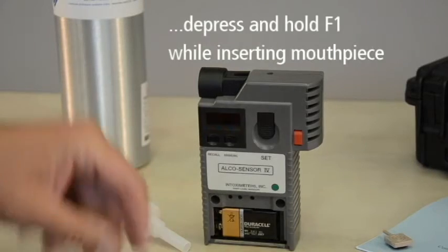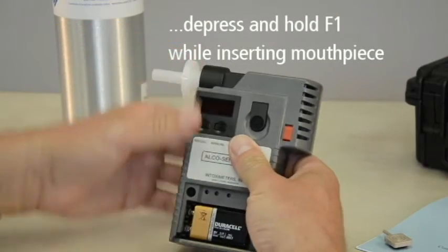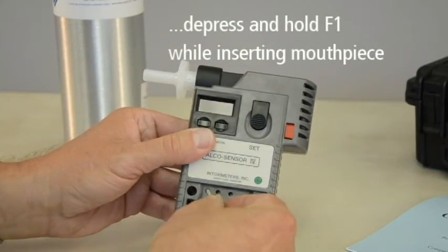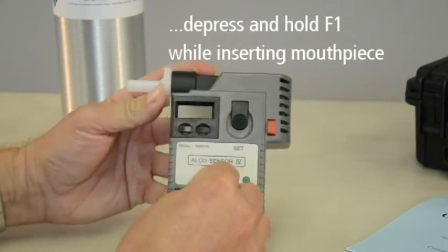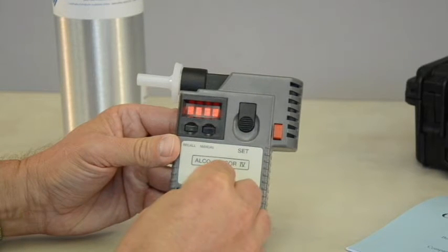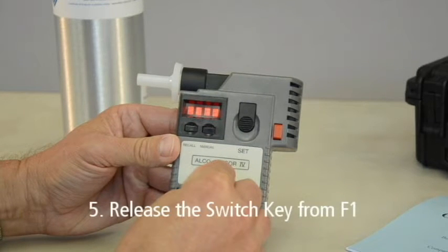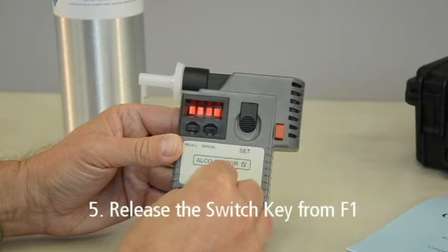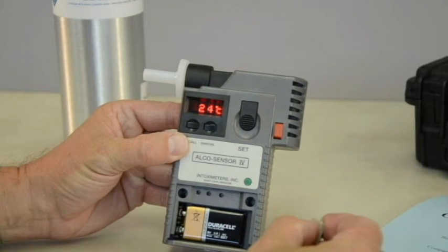Using the switch key, depress and hold F1, which is the far left hole, while inserting a new mouthpiece. Four solid blocks will appear on the display. Now release the switch key from F1.